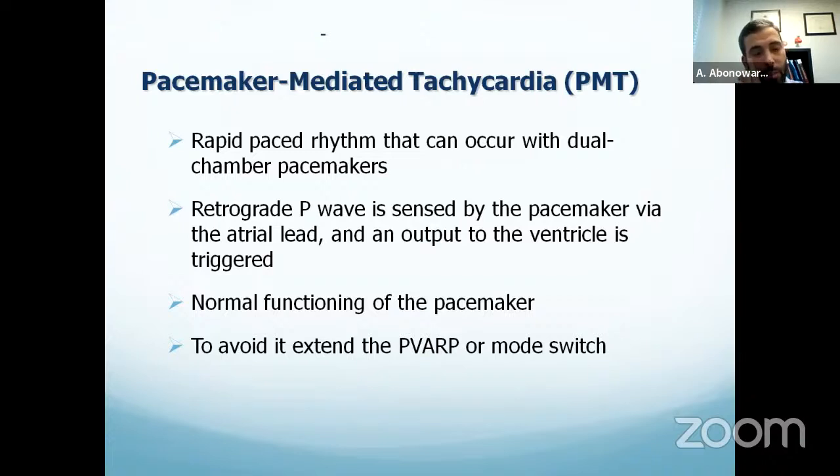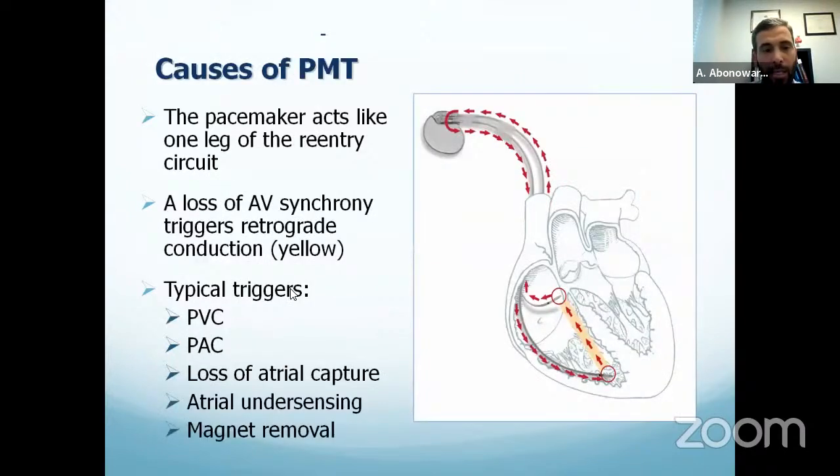It happens only in dual chamber. So remember, it doesn't happen in the single chamber. It's only in dual chamber pacemaker. And that's how it looks.